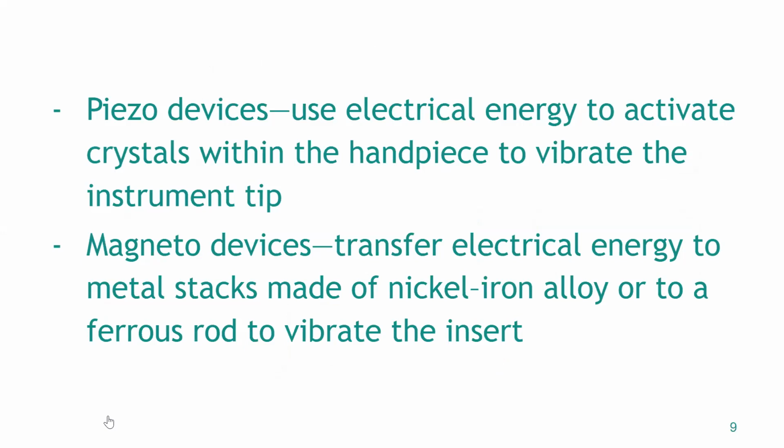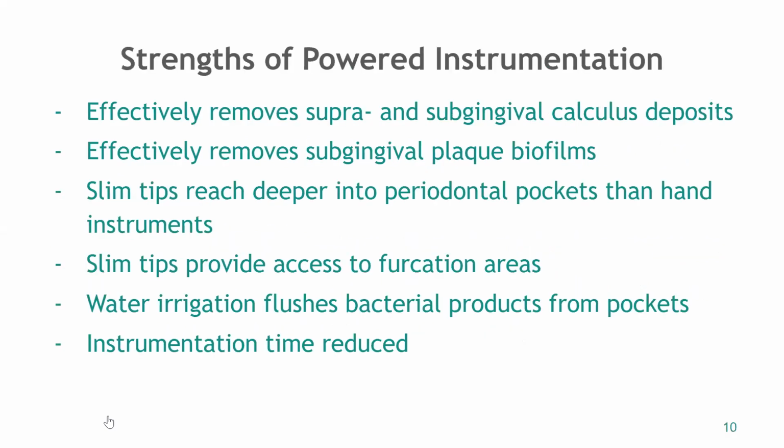This is important to know as far as a board exam question. If there's anything that mentions crystals, that's going to be your piezo. And then anything that mentions metal stacks, that's going to be your magneto devices, or the brand name for that, which is most commonly Cavitron. Okay.